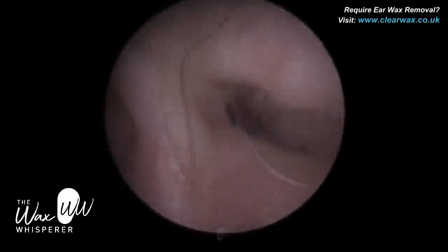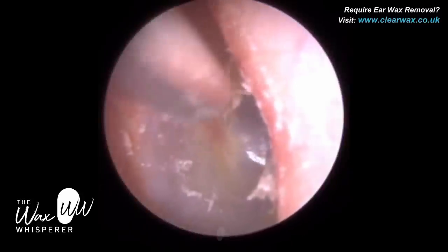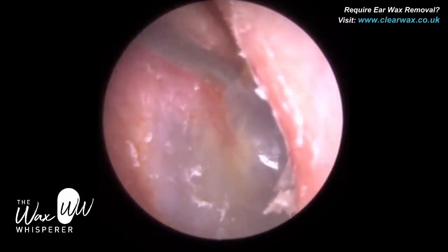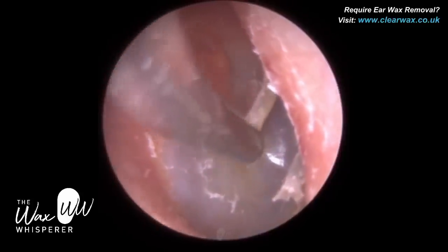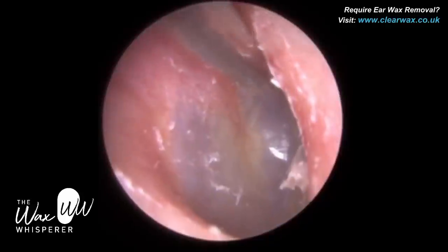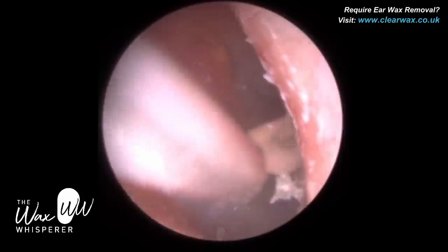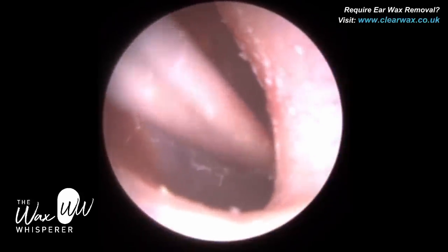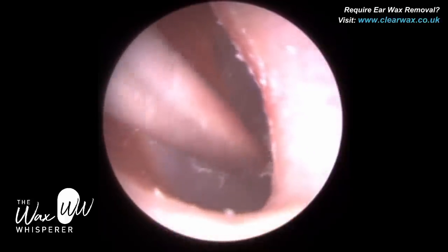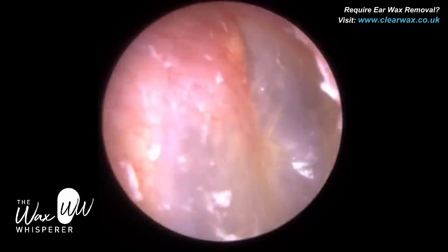There is a bit of skin left in the anterior recess, which is very difficult to access. I've got the fine end tip and I've bent the distal length — the bit where the sucker is — just to enable me to curve around the anterior canal wall so I don't make contact. We've just managed to remove that bit of skin. There's the patient's eardrum.